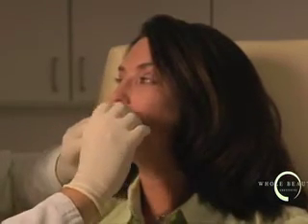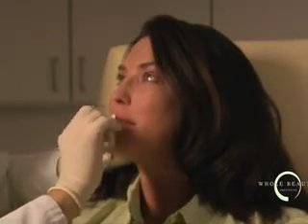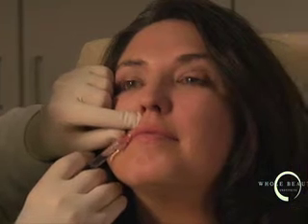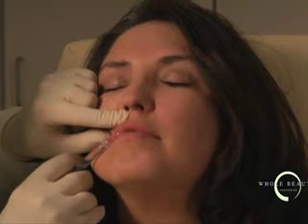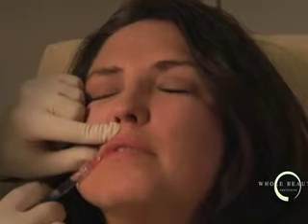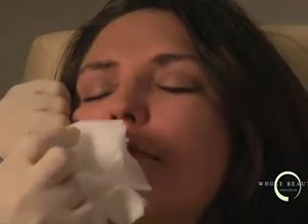So Sean now has a dental block which has numbed the lips quite convincingly, and I'm just cleansing the area with a little alcohol just to prepare for the injections. It's important to be very precise and respect the anatomy. You may feel just a little something as we go in here, and then we're going to have a little volume on the right side of the upper lip. There we go. Just a nice gentle amount, nothing overdone.